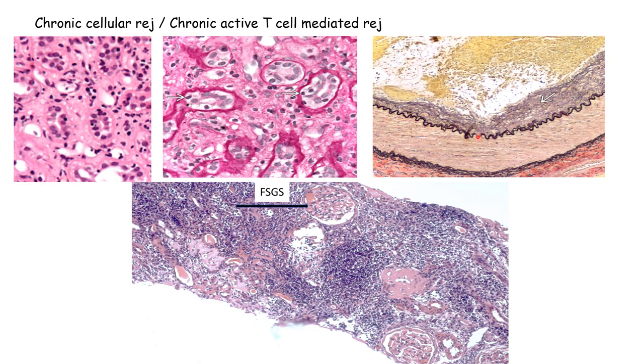Sometimes the vessel is also affected. You can see that this is an elastic stain because it has marked the internal elastic lamina. Lying on the inner side, just below the endothelial cell, are a few foam cells and an increase in the reticulin fibers, suggesting changes of chronicity.